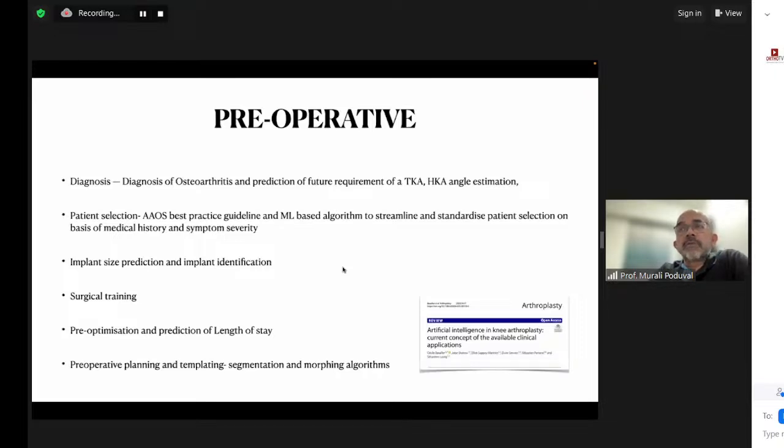Now, this would matter to me because this was actually based on a single implant data set. But most manufacturers have different implant sizes. Therefore, this would be a challenge in the near future, because every implant manufacturer has their own physiology and their own fundamentals in determining implant size. So you cannot have a single algorithm for all the manufacturers.